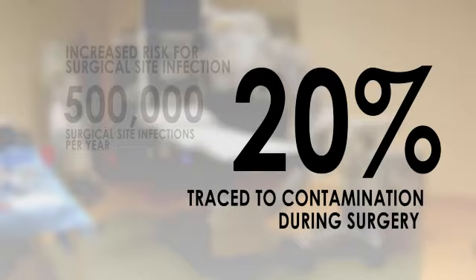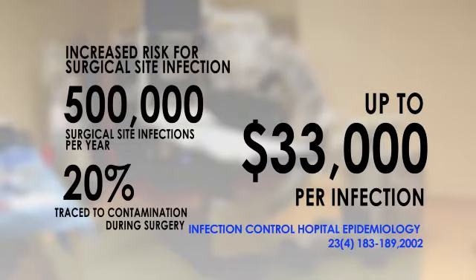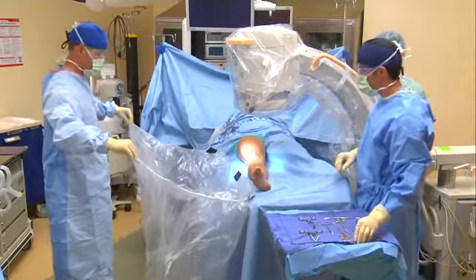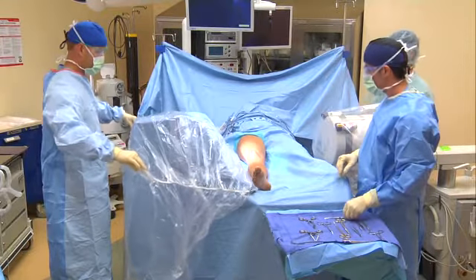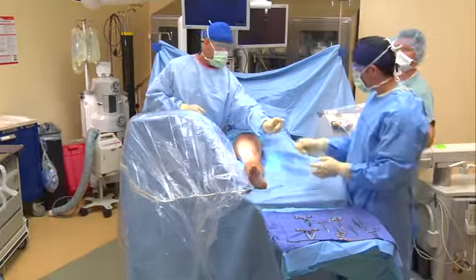A single surgical site infection can cost an institution up to $33,000, and Medicare, CMS, will not reimburse hospitals for certain hospital-acquired infections. The C-arm is utilized for both lateral and vertical plane fluoroscopic imaging in many surgical disciplines, including orthopedic and spine surgery, interventional radiology, and vascular procedures.